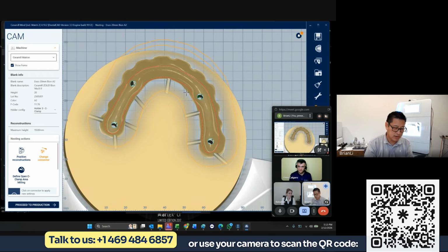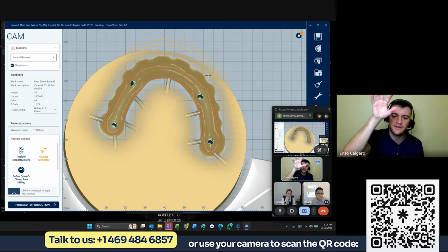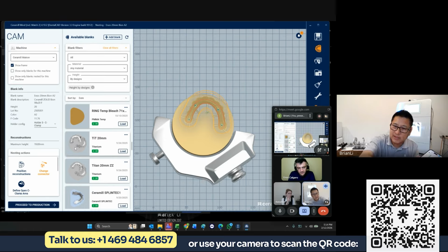So what I can share with you guys is I took pictures. Brian, while you take the pictures, I'll ask you one question that I get asked a lot. If I use this blank and I don't have to use it for another 2 or 3 days, I can just go there, pull the blank on the system. It's going to have the milled out area, and I just place the other cases, right? Yeah. If you look at my library of blanks that have previously been used, you can see that any partial blank stays in here. You can select that one, bring it back in, and then use the area that hasn't been used.